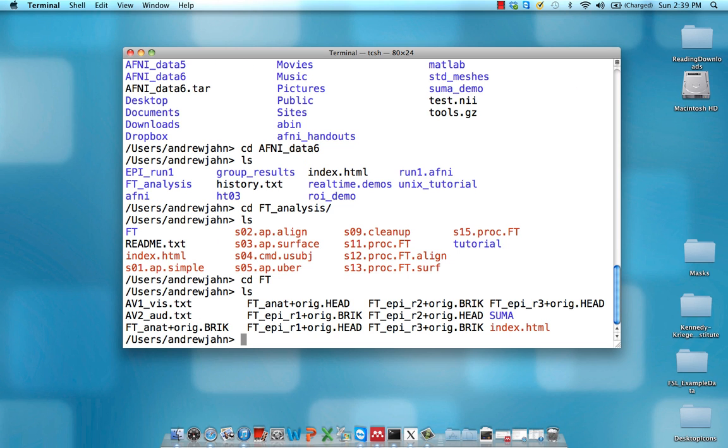So first, let's go into the ft directory, and we see that we have an anatomical dataset, ft_anat. There's a brick and a header extension. Brick is the raw data, or the more substantial data. The head is just a header file which points towards where the actual data is located in this brick file.